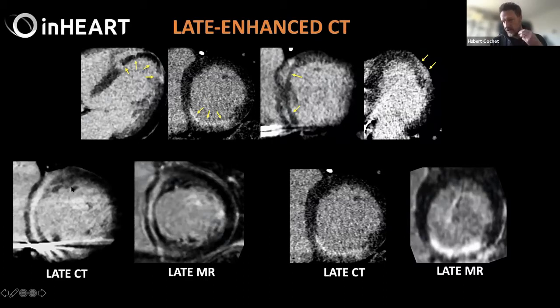You take advantage of the spatial resolution of CT, which is 0.5 millimeter. And maybe we'll get to that later, but the artifacts from the ICD are much lower than on MR. There's just the lead that is hampering a bit the septal assessment, but for the rest of the heart, it's okay. So is LIE on CT needed for all patients, or does it vary?